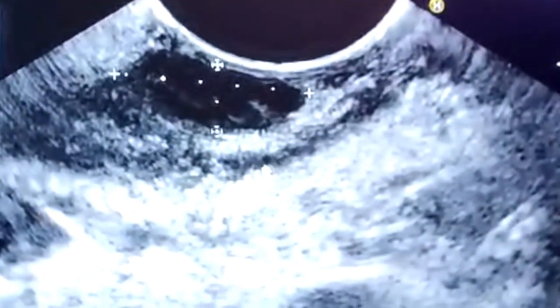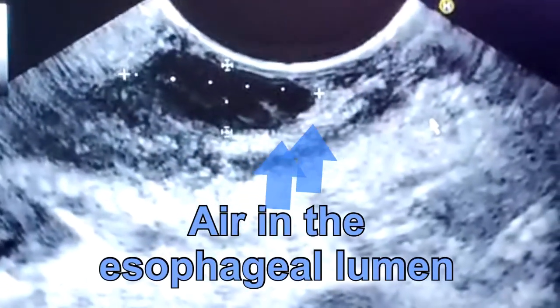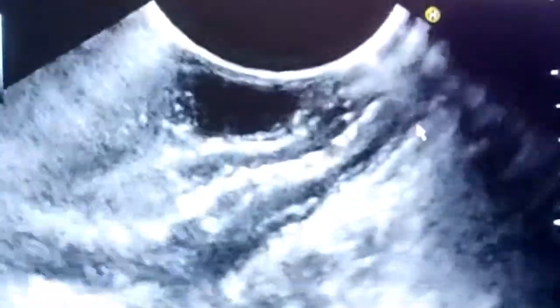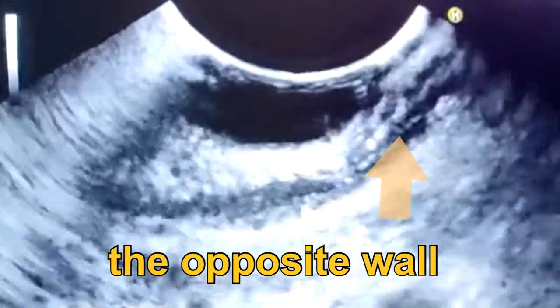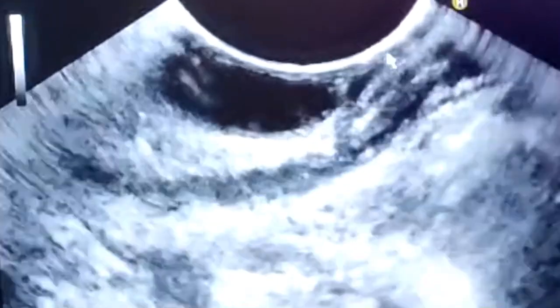the opposite wall. So when we count the layer, this is the double wall layering effect. This is the opposite wall, because this is a lumen with air inside. This is the esophageal lumen with air inside, and this is the opposite wall. And here we count this wall. Here, this is the muscularis propria.